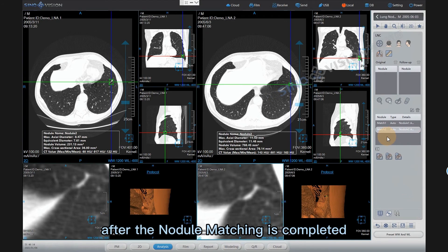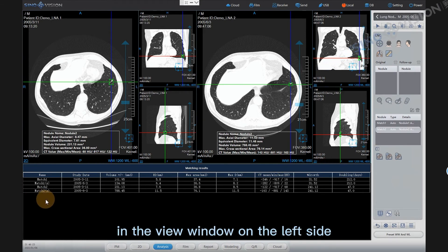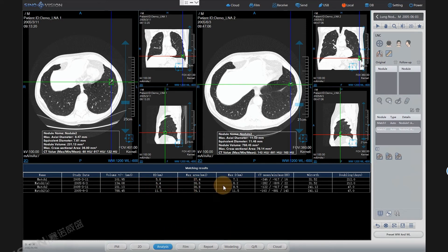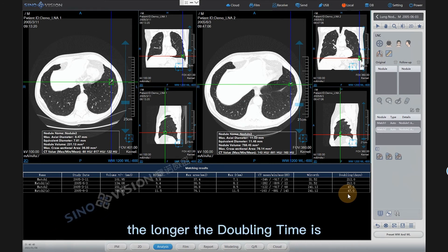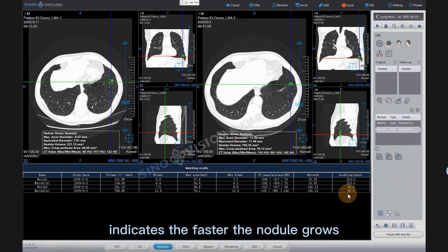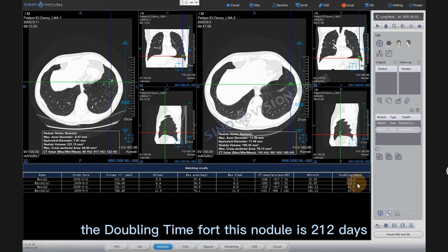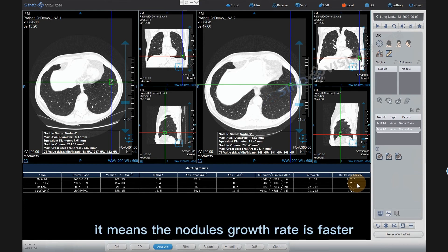After nodule matching is completed, click the display matching results icon, and the nodule matching results will be displayed in the view window on the left. Here we can see the study date, volume, effective diameter, area, maximum diameter, CT value, growth rate, and doubling time (doubling days) — the days required for the nodule to double. The longer the doubling time, the slower the nodule grows; the shorter the doubling time, the faster it grows. For example, the doubling time for this nodule is 212 days, indicating that the nodule's growth rate is slow. If the doubling time is 20–30 days, it means the nodule's growth rate is faster.